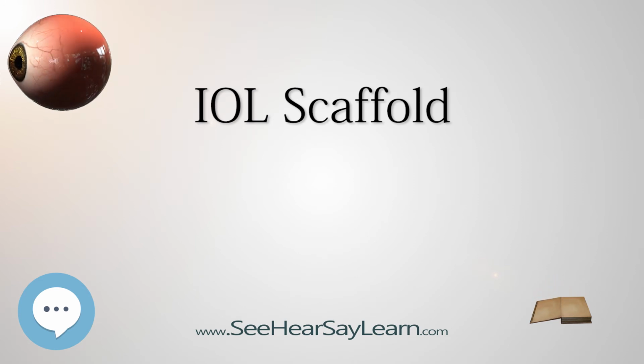IOL scaffold for foreign body removal. External foreign bodies can enter the eye and can get lodged on the retina or vitreous. This is often removed through the open method of opening through the sclera, white coat of the eye. While removing large intraocular foreign bodies, IOFB, it may drop or slip onto the back part of eye again. In order to prevent this, the IOL can be placed on the sulcus or glued to the sclera and the IOFB can be removed over it, Fig. 4. This will prevent the accidental slippage of IOFB into the eye.